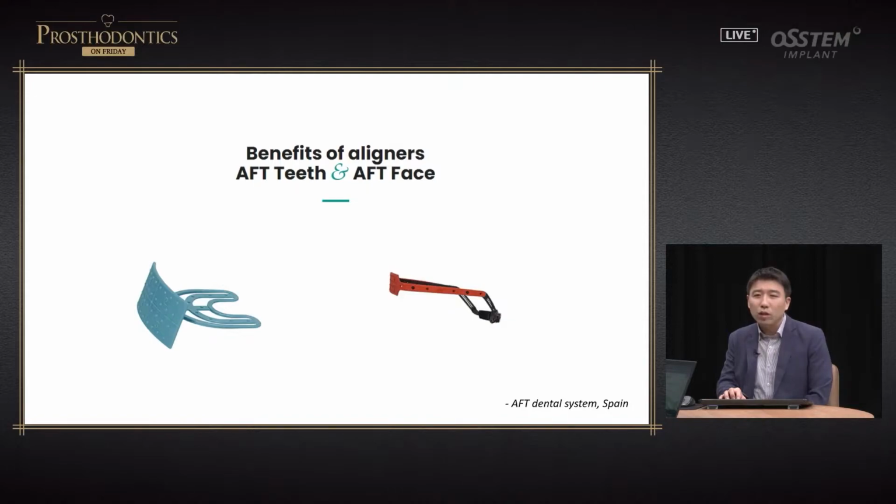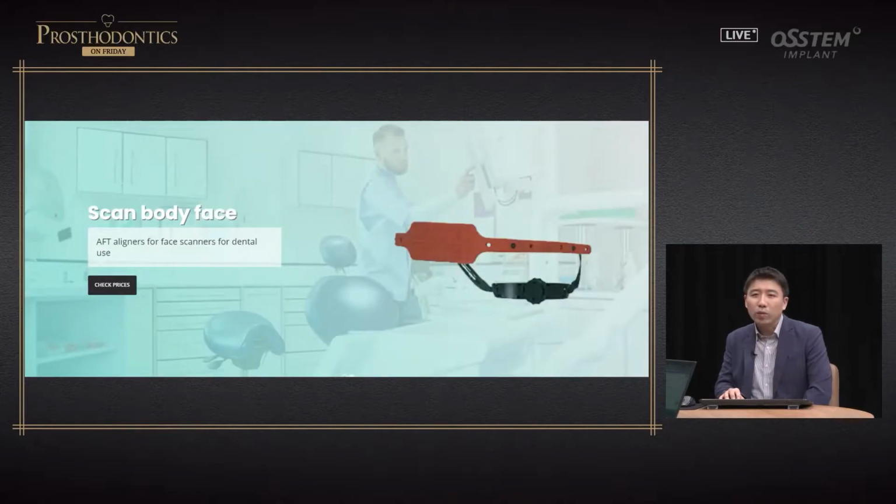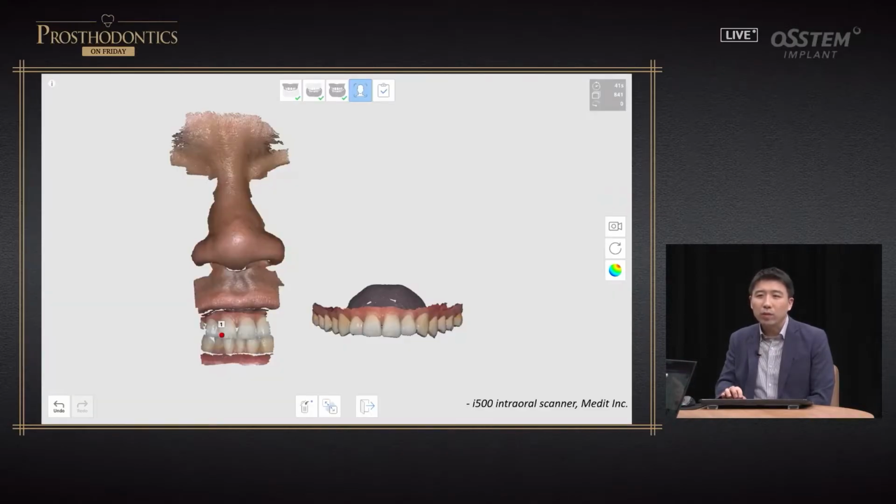We can design our own. You don't have to use that. You can design the jig and use it for facial scans. I believe it is necessary to use a jig when you scan facial scans and teeth. Headbands, you don't really need the landmark on your head because there's the T-zone where it transitions from the eyebrow to the nose. I don't believe the landmark on top of your head is absolutely necessary.